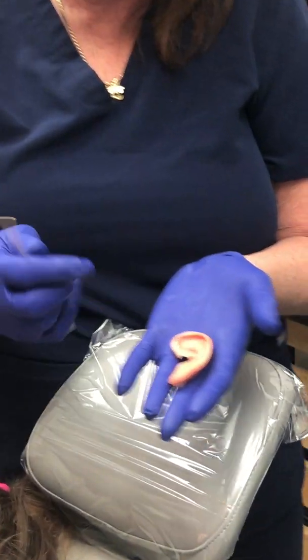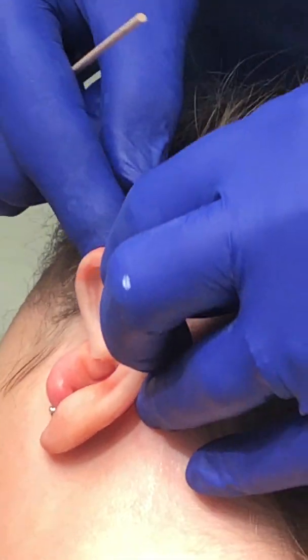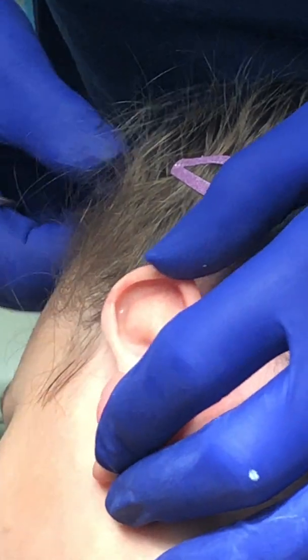This is her prosthetic ear that will go on her defect, her little microtia ear. If you see the way it fits, it goes in here, comes up on top, and will fit nice and snugly on her ear, showing her earring.